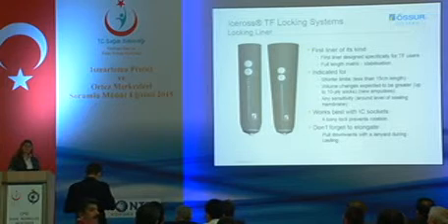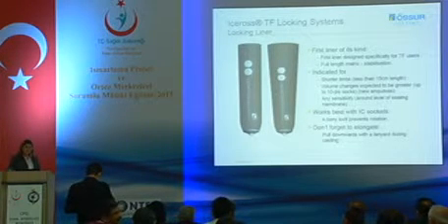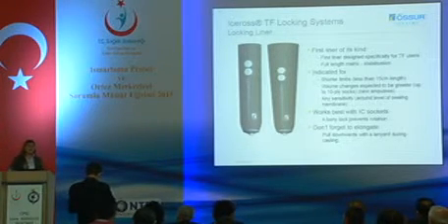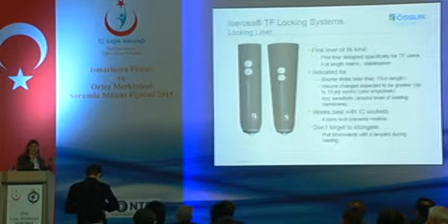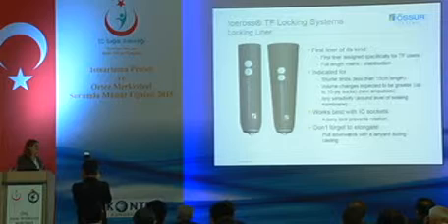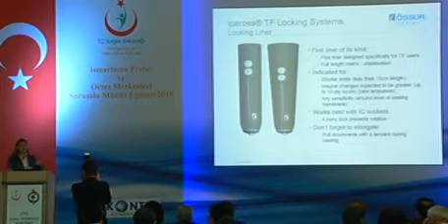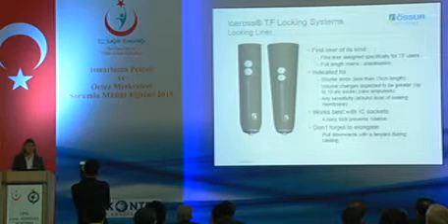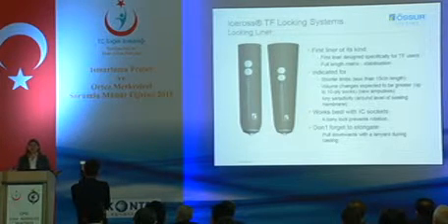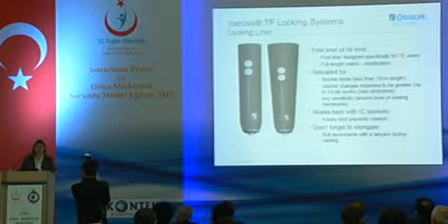Volume changes as well. So when they're, for example, new amputees, what we can find is that they lose volume very quickly when wearing a liner. But because we have our distal attachment at the bottom, it means that the suspension will still stay on, and they can use socks to fill up the volume changes.